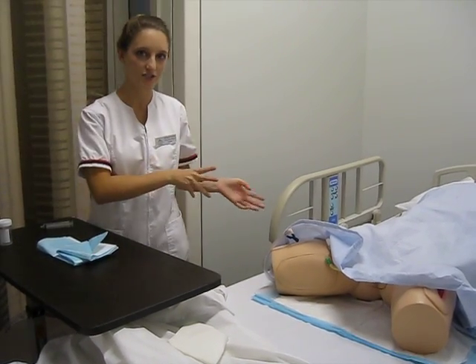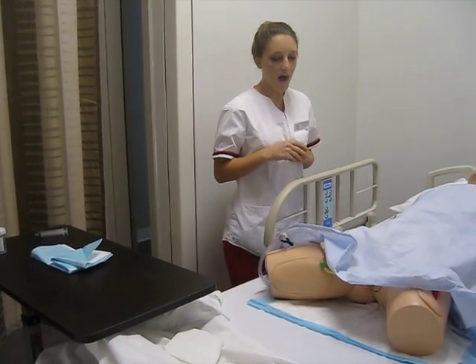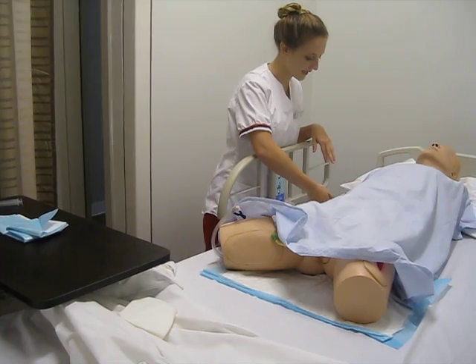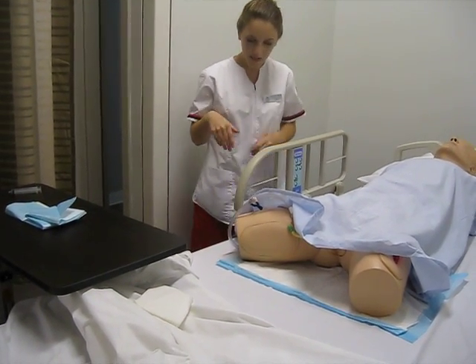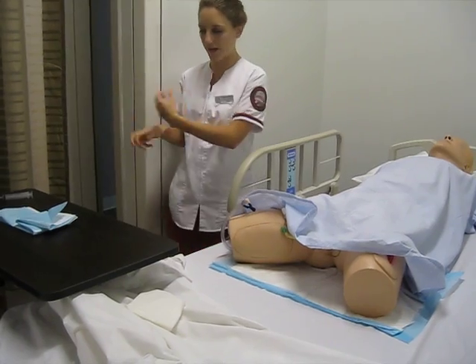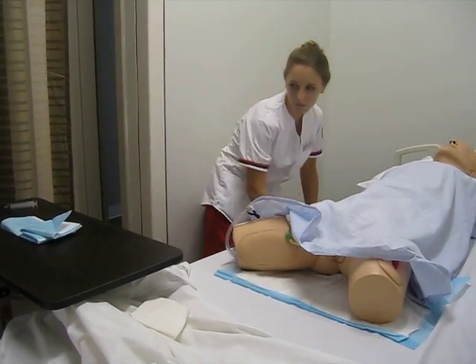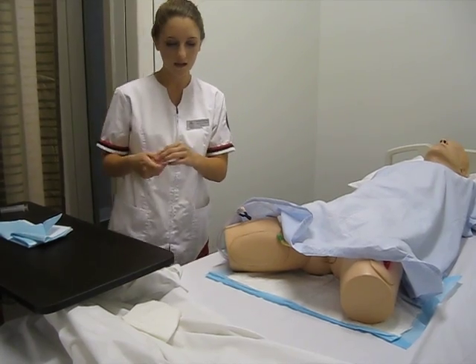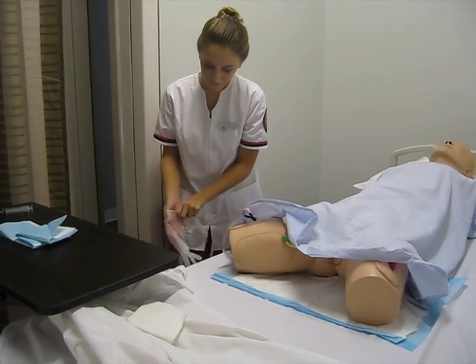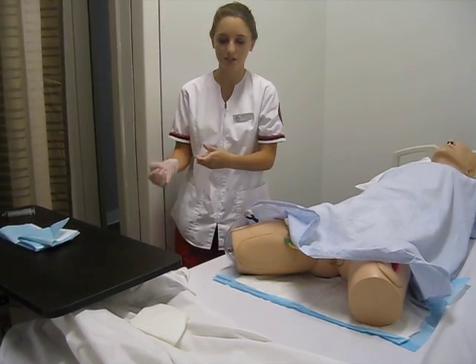Now I will come back into the patient's room — this is several days later to remove the catheter. Hello, my name is Janie, and I will be your student nurse today. Before we get started, I'm going to close the curtain to ensure our privacy. Can I have you confirm your name and date of birth for me? We will be removing your catheter today. Do you have any allergies I should know about? I'm going to wash my hands and lower the patient's bed and side rails. I'm putting on my gloves. I have already emptied the urine from the Foley bag prior to coming here, according to institution policy.